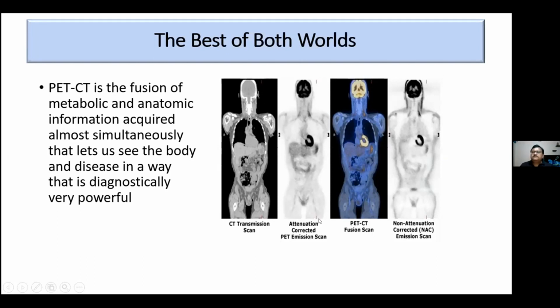What happens is that the rays coming from the periphery are not attenuated by the tissues. But for example, if a cancer is there in the vertebra or the liver, the ray coming to the scanner has an attenuation from the normal liver. It may have an attenuation from the abdominal muscles or the vertebra or the bone. So we will not be able to see it.